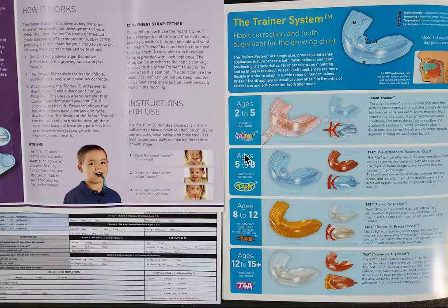But you have to know how to use them. So you can't just randomly throw them at a patient because it's not going to work. And you need to know what cases are going to be appropriate. And of course, you need to have a great compliance system set up in your office already. So if you know how to use these and what cases to use them for, you will have success, assuming you have a great compliance program set up.